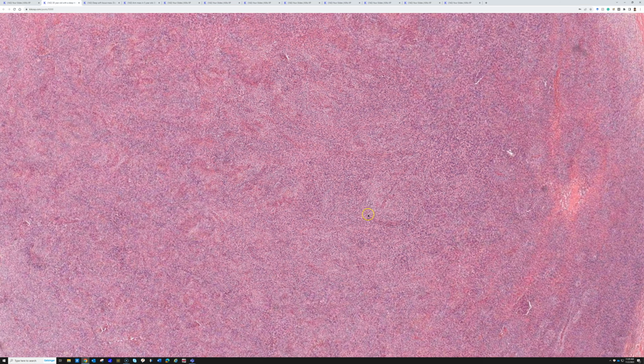I had a case like this not long ago, where the round cells didn't really make the classic cords, or they vaguely made cords like you see right here, but without very much collagen in between. I struggled with that case, and then I saw that it was mingled with some bland spindle cell areas that vaguely reminded me of low-grade fibromyxoid sarcoma, and then I did MUC4 and it was positive, and that solved the case for me.